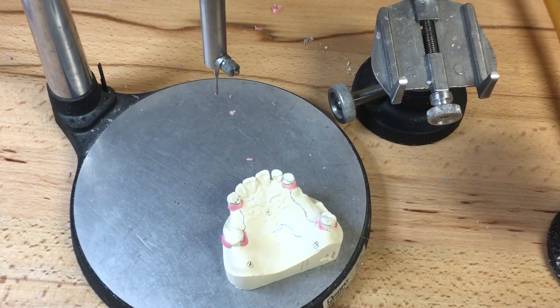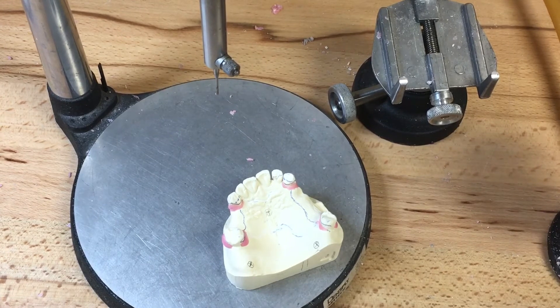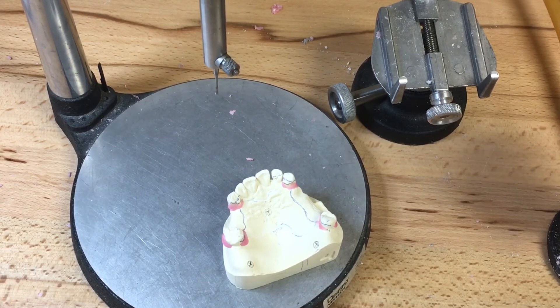Being beginners or novices in cast partials, we'll use the bead line, and this will aid in our trimming — at least we have a definite endpoint of our trimming to guide us after casting. Naturally the bead line is not as deep in the mid-palatine suture, as this is a bony eminence; it can have some depth closer in the soft tissue. Last but not least is our block-out for our mesh acrylic denture base on the first and second quadrant.